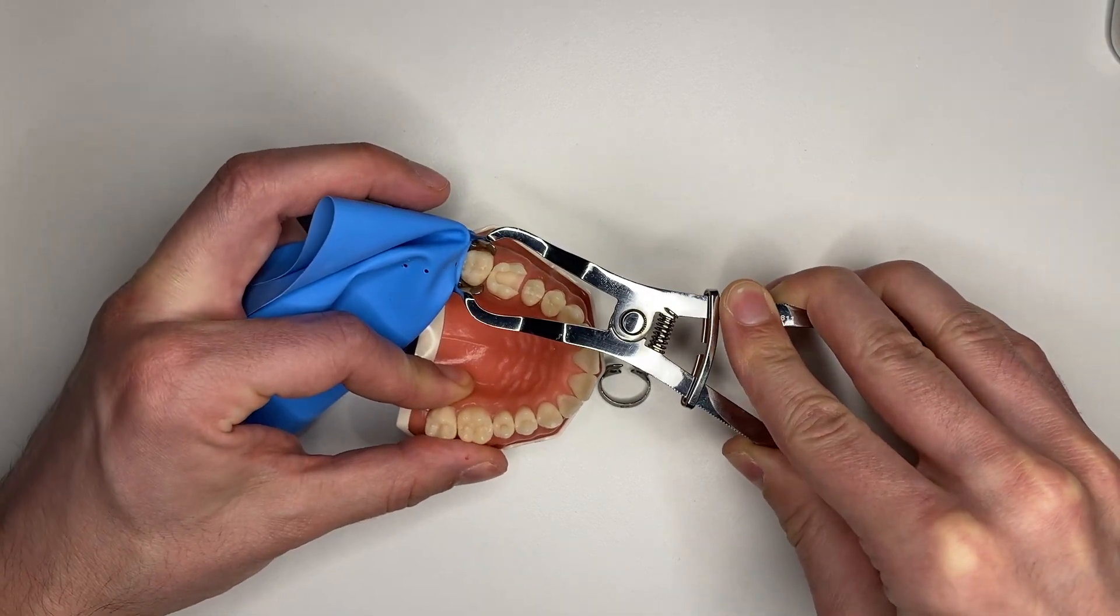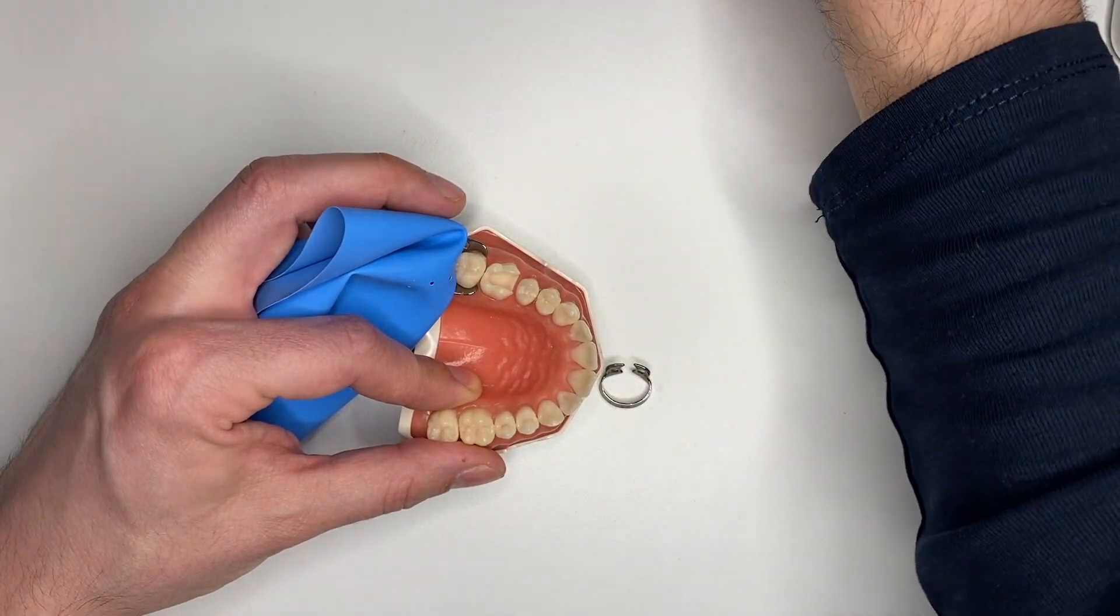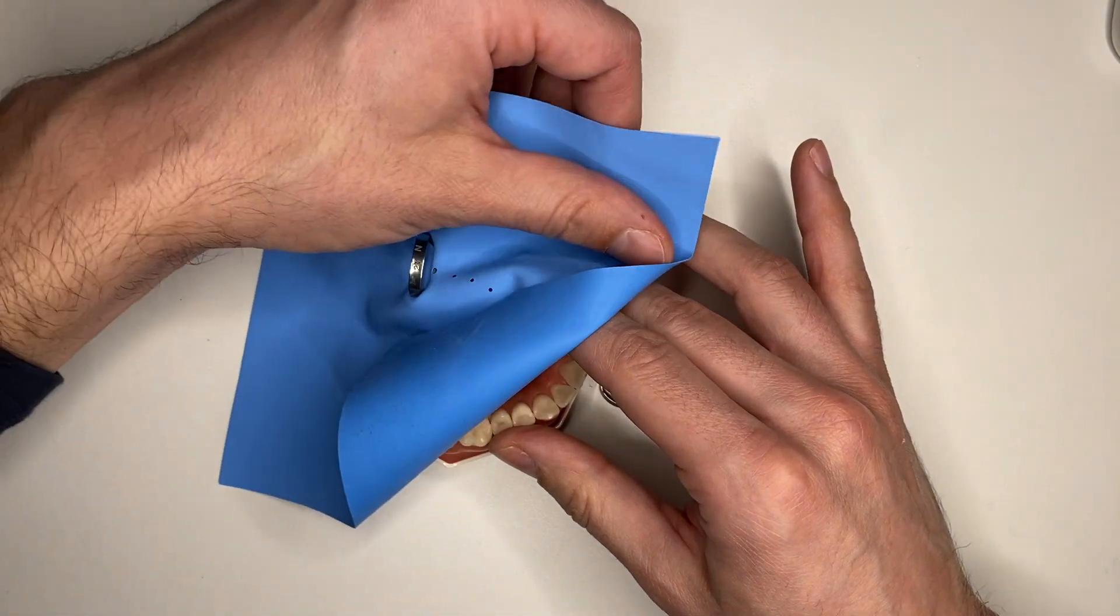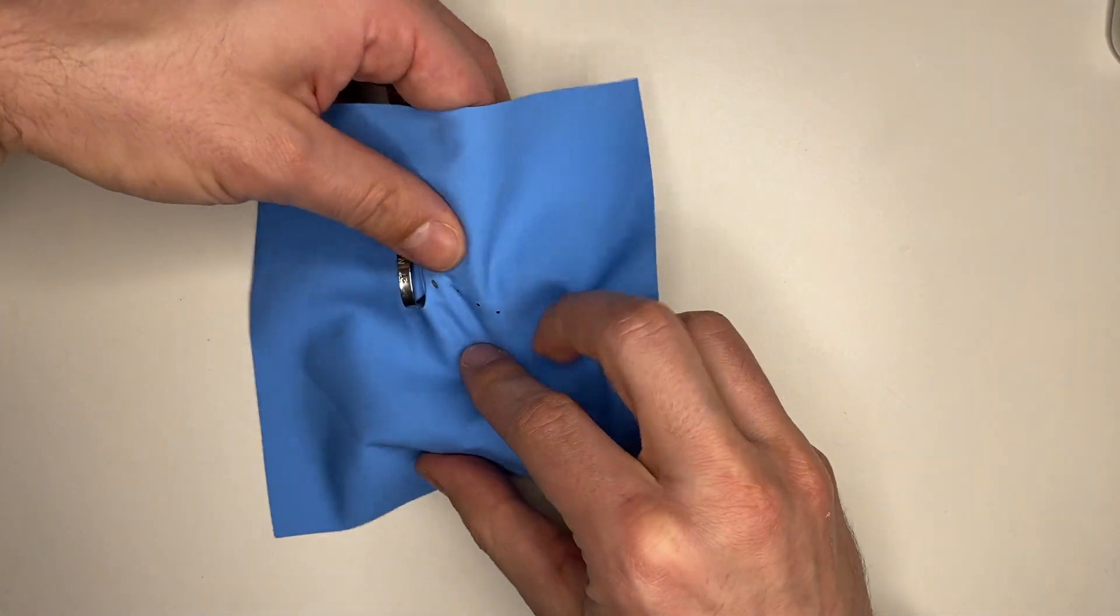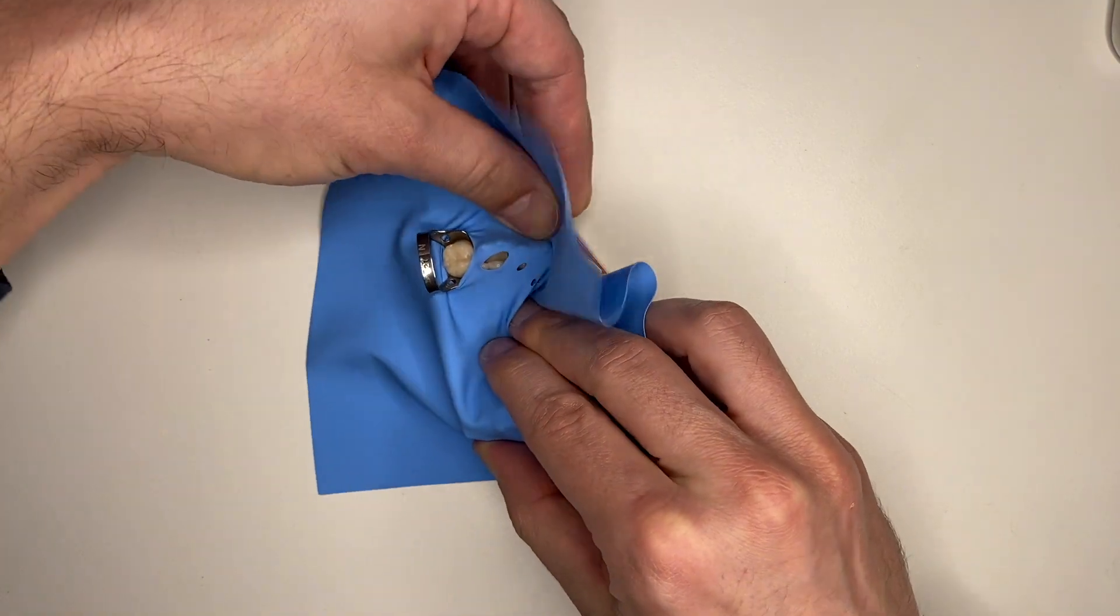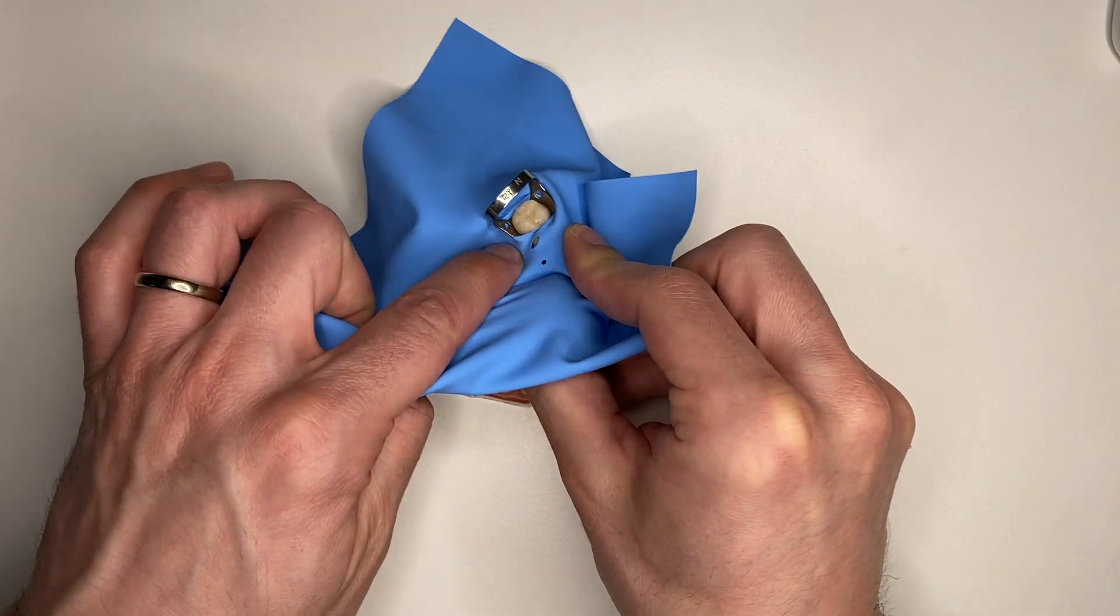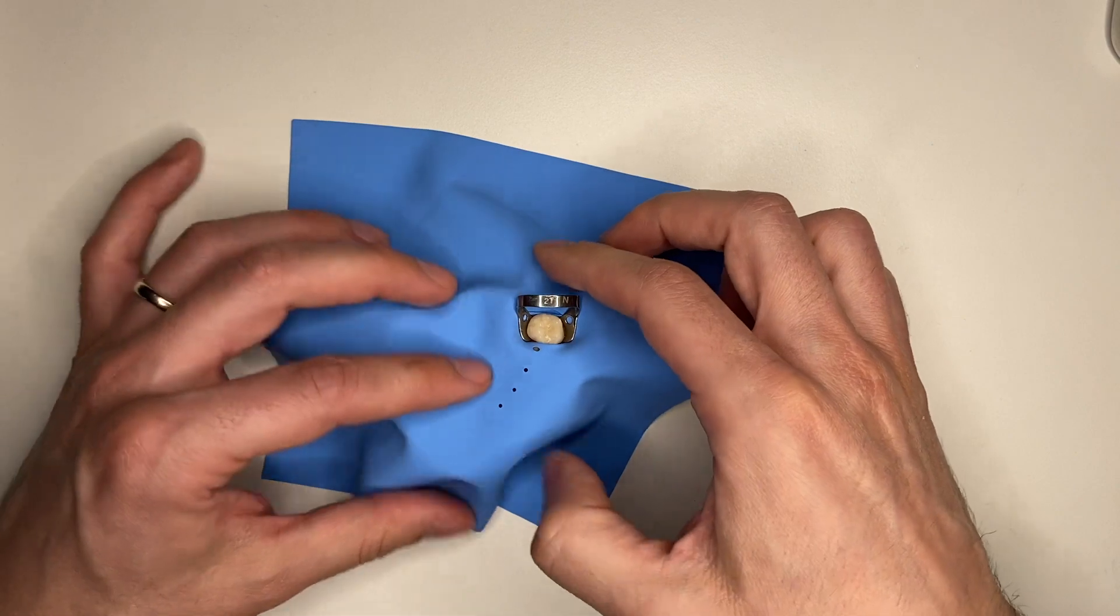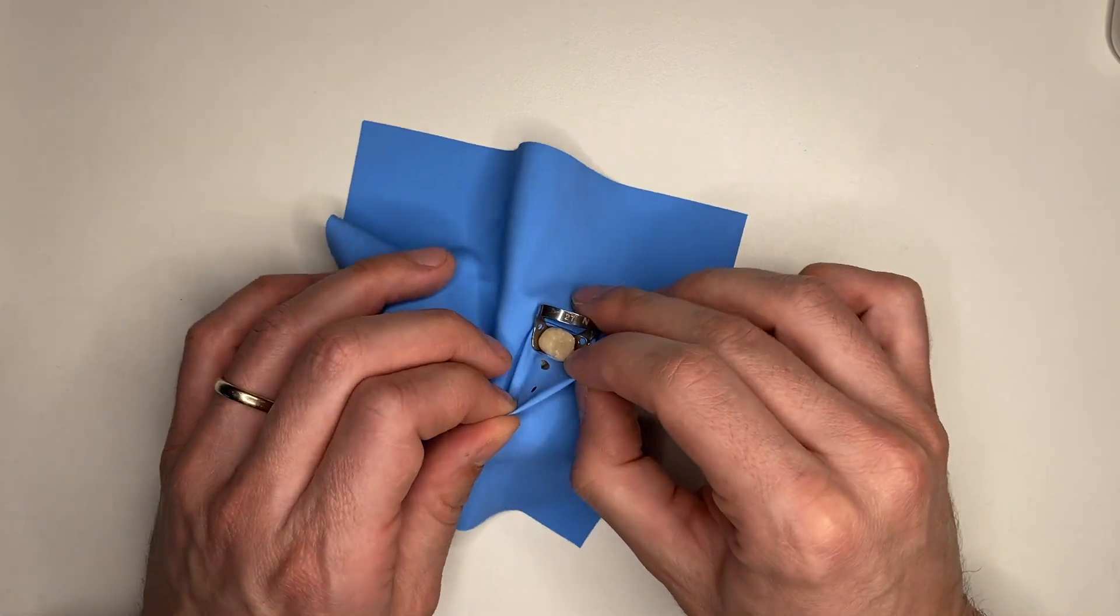We are going to go to our second molar like this and allow the clamp to bite, then remove the pliers from the clamp. Now what you want to do first is to take the rubber dam over the rubber dam clamp. Don't mind anything else, just take the rubber dam over the rubber dam clamp like this. This is your first step towards isolation.